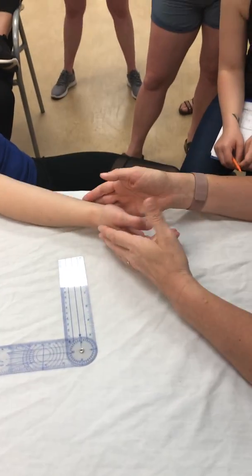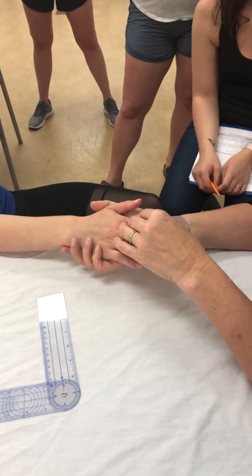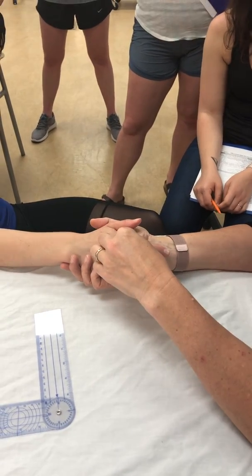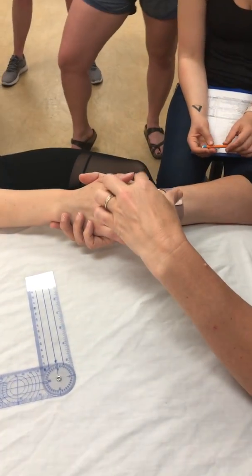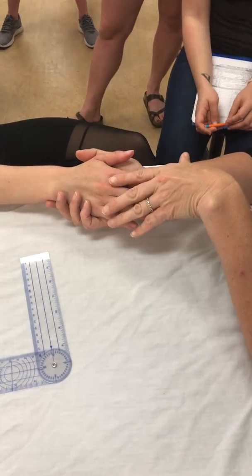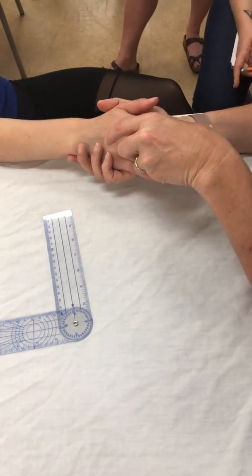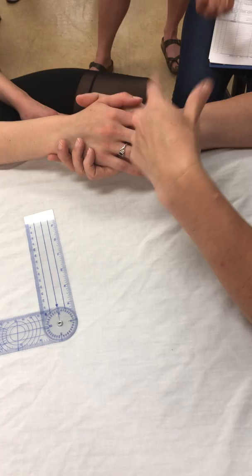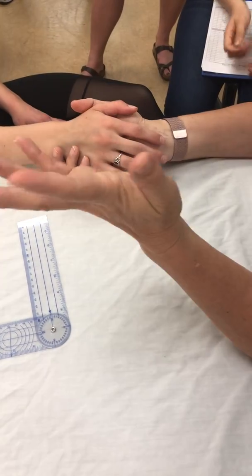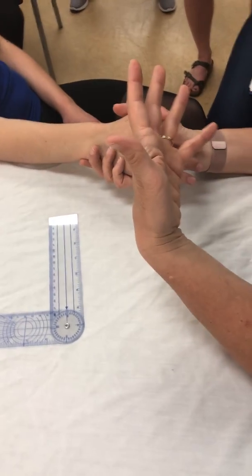What about for like the middle finger? What side would you go on? So normally you would have a goniometer that you can actually put right on top of the joint, and they have very small arms. So there's a special goniometer for fingers. So for the exam, you're only going to be asked to measure like MCP, PIP, DIP of digits 2 through 5. You can measure that either for 2 or for 5, but we don't have the tools needed to test fingers 3 and 4. Okay, so just test one of those two, and you'll only be asked. We're giving you a choice of a dozen different joints you can measure. You just need to measure one, and you get to pick which one you measure.